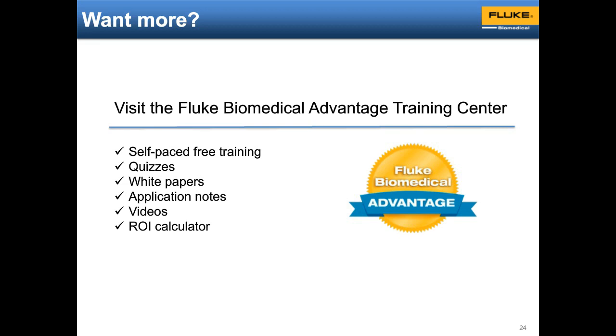Okay, and is the R curve associated with the monitor or the probe when the manufacturer of the monitor uses other probes? Probe. The R curve goes with the probe because it's dependent on the sensor and the photodetector and usually the associated firmware that's embedded. So when one medical device company who produces the SpO2 sensor embeds that into another device, they usually carry over all of the sensor company's firmware and R curve. So it goes with the sensor.